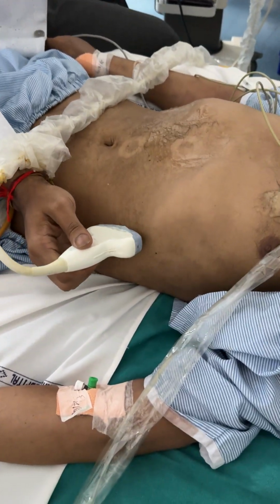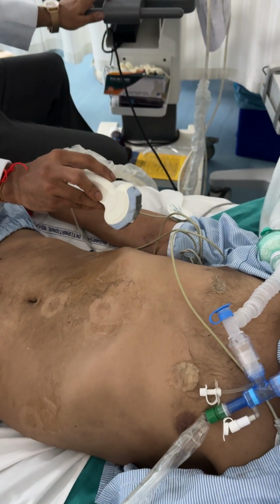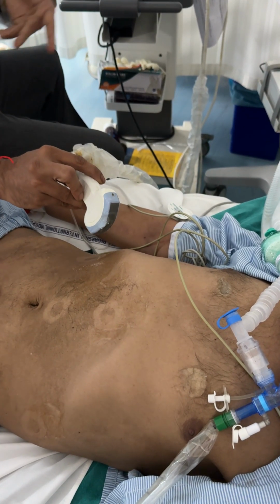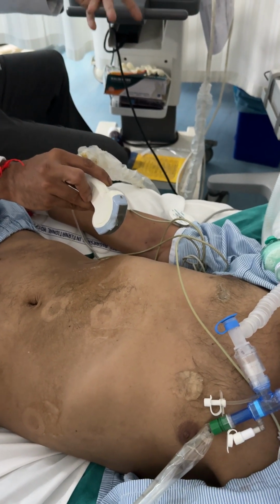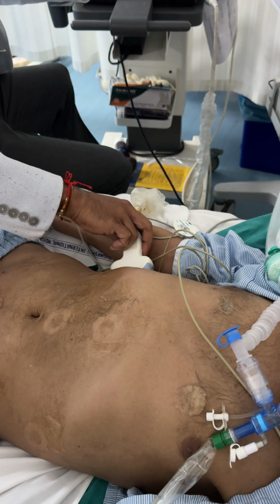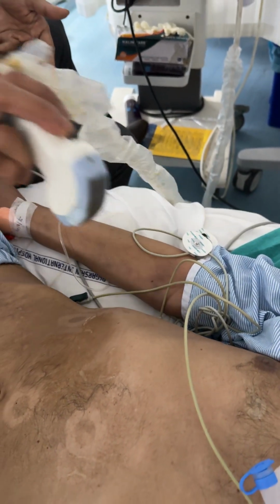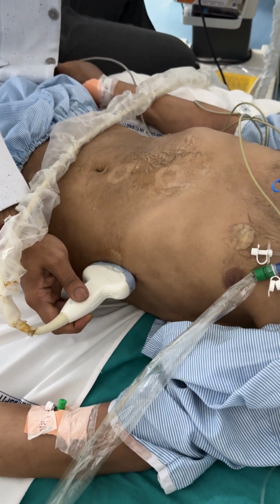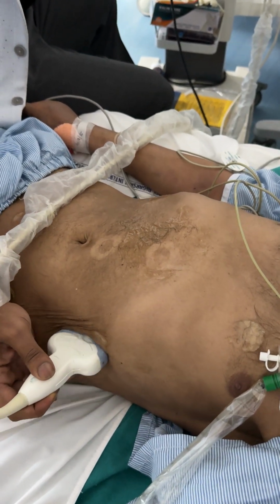Now the left upper quadrant view. One more thing: when you see the right upper quadrant view, the ideal position is posterior to the mid axillary line, like this, in the 7th to 11th intercostal spaces. Whereas when you go to the left upper quadrant, the position is slightly up, because the spleen lies slightly up. So I'll show you the spleen out here.